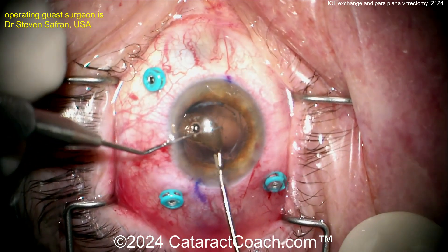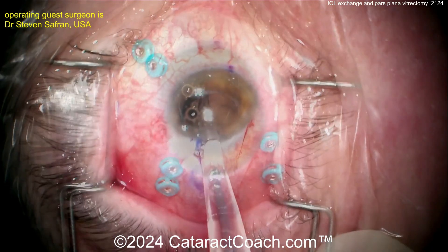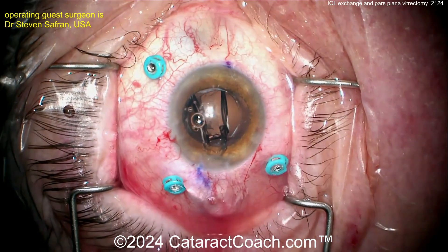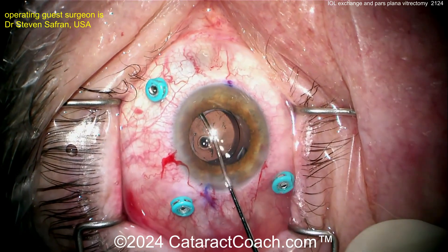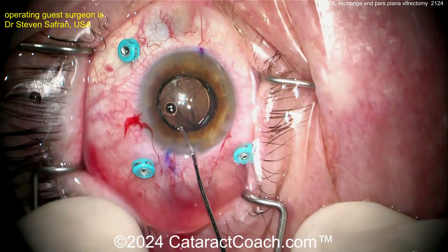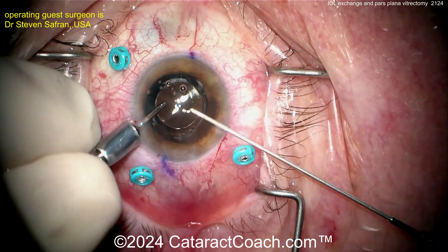Getting that other half out. Now it's going to be time to clean up all that vitreous debris. We've seen more and more presentations showing that a lot of the vitreous debris and opacities can have an effect in a refractive sense and cause poor quality of vision. Here comes the new IOL now, going right into that capsular bag. It looks like a toric lens as well, getting that positioned appropriately. And now cleaning up with what looks like a bimanual setup here.